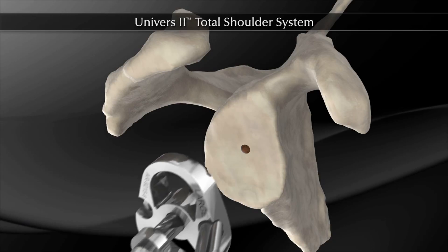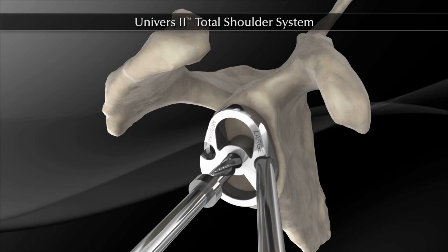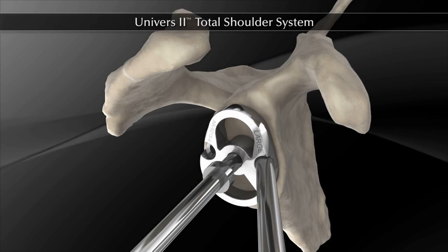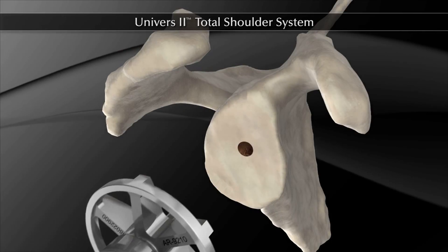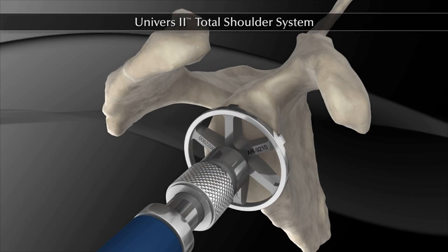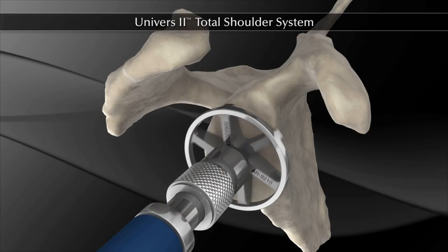Place the 6 mm drill through the appropriate size number one drill guide and center the drill into the pilot hole. Begin drilling and continue until the mechanical stop on the drill engages the guide. Remove the drill and guide. Next, the appropriate size glenoid reamer is assembled to the reamer shaft. The nipple end of the reamer is inserted into the central glenoid drill hole and reaming is initiated.